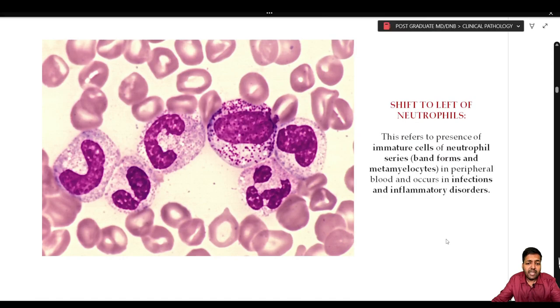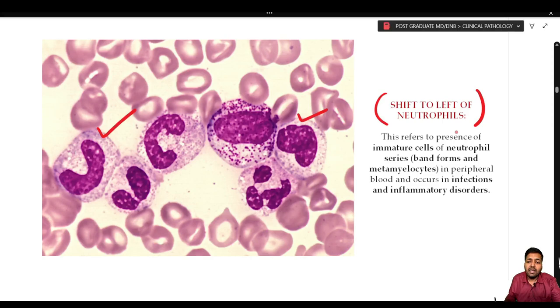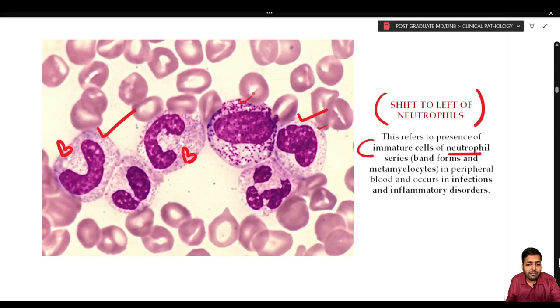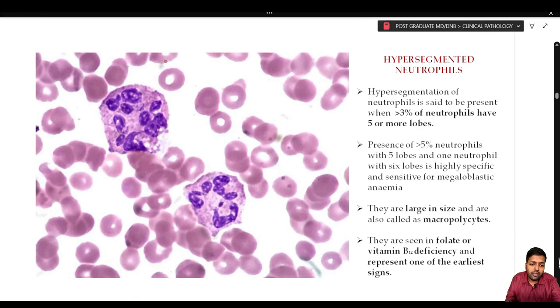Sometimes you will see certain precursors in the peripheral blood — band forms and metamyelocytes — this is called shift to the left. Shift to the left refers to the presence of immature cells of the neutrophil series, mainly band forms and metamyelocytes, or sometimes myelocytes. This is indicative of infectious or inflammatory disorder and is a very commonly encountered abnormal morphology.